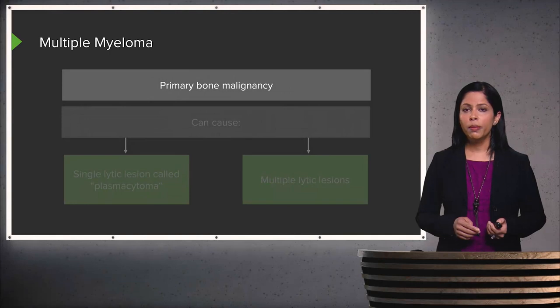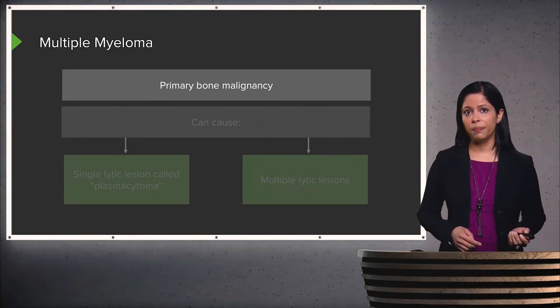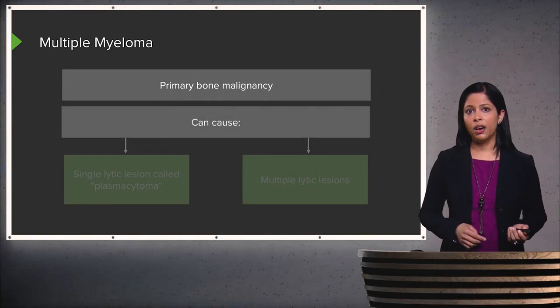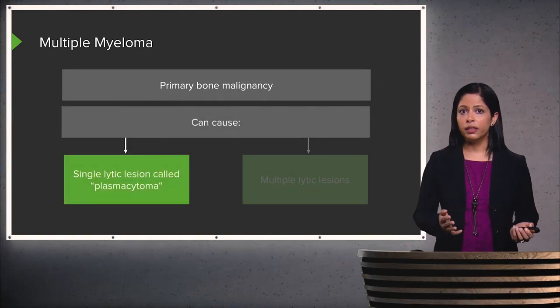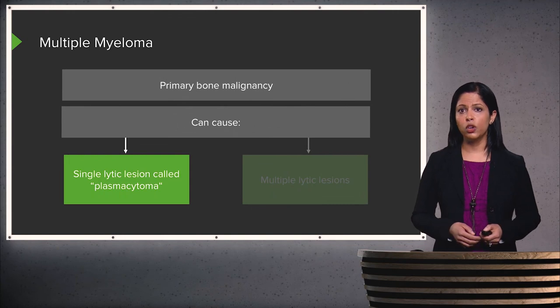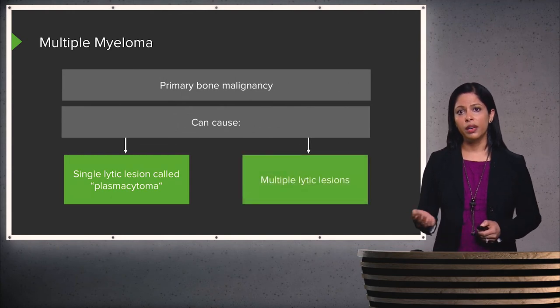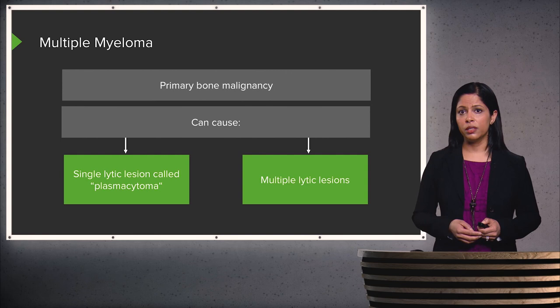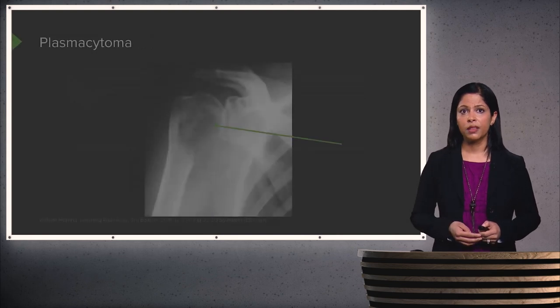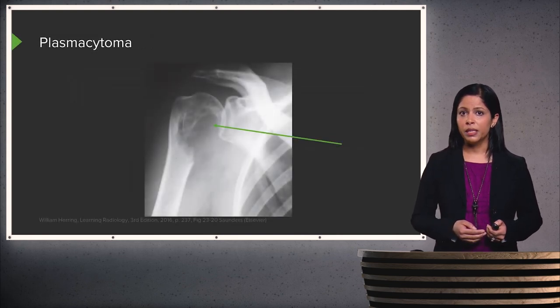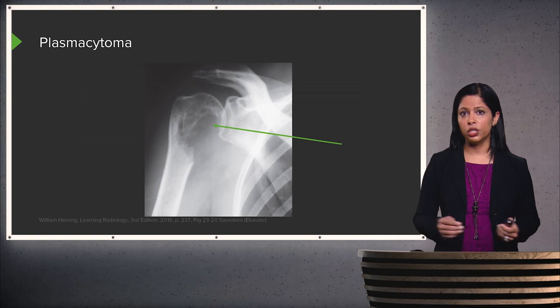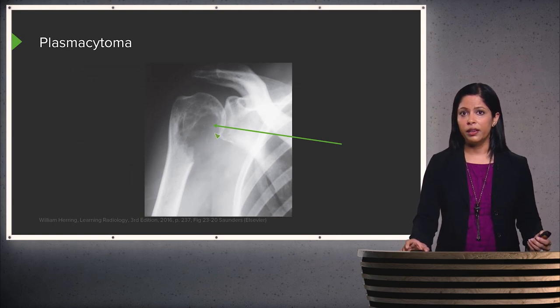Multiple myeloma is a primary bone malignancy. It can cause either a single lytic lesion called a plasmacytoma, or multiple lytic lesions with a punched-out appearance as we just saw. This is an example of a plasmacytoma — a single lucent lesion within the right humeral head.